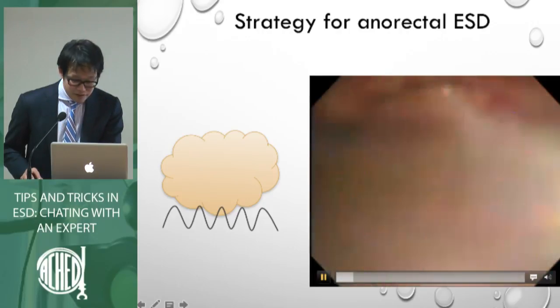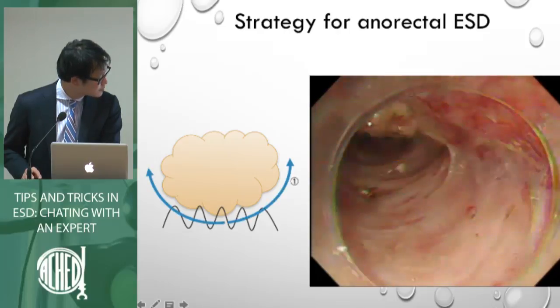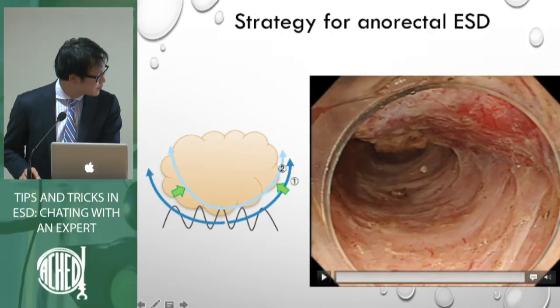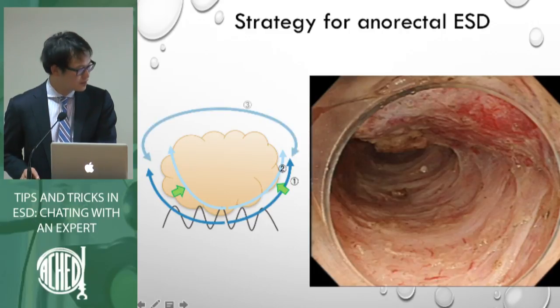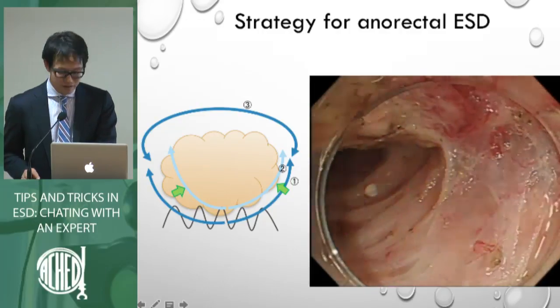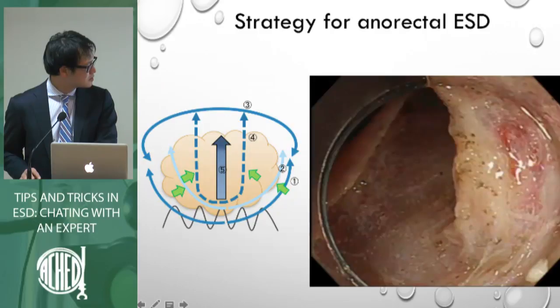So finally, initially cut, and then side cut, it's like a wave sign. So we dissect the side, and so finally we remain the center region, and we finally cut it.